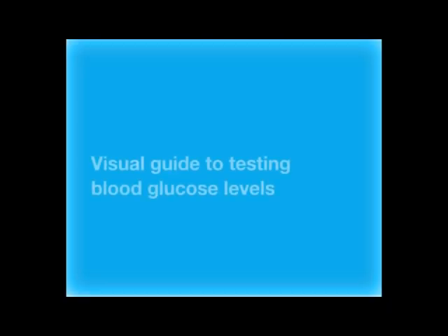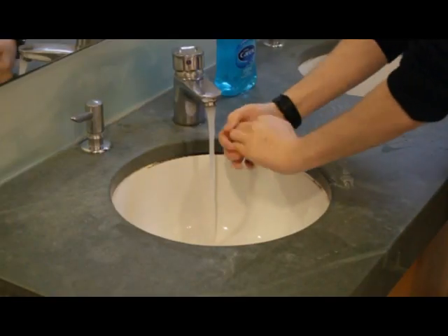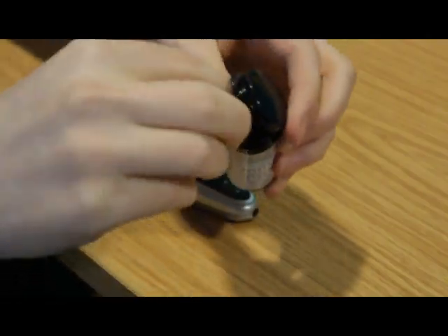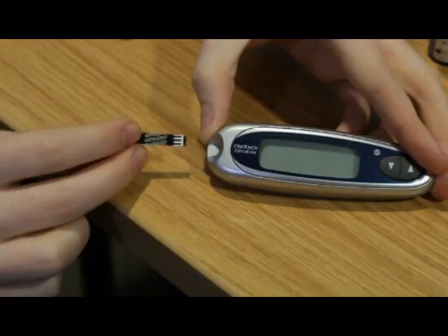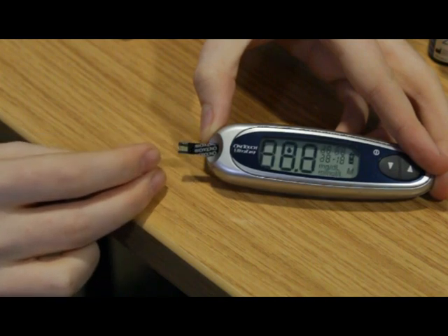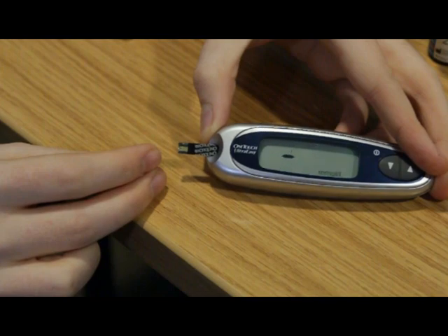There are several steps you need to take in order to test your blood glucose levels. Wash hands with soap and warm water, rinse and dry. Remove the test strip from its pack. With the meter off, insert the test strip according to the instructions — this usually turns the meter on.